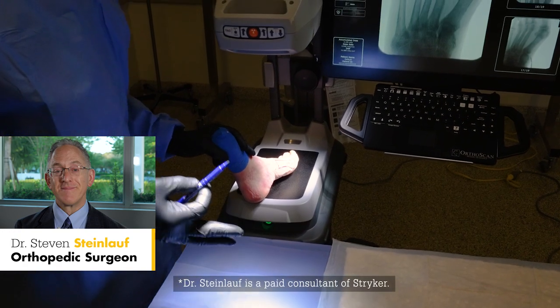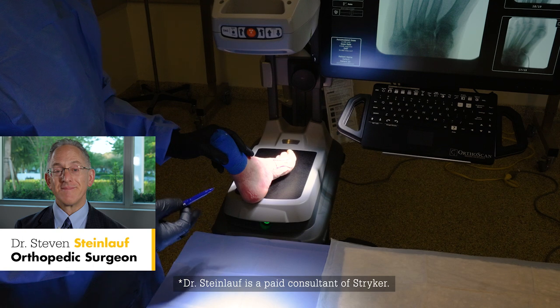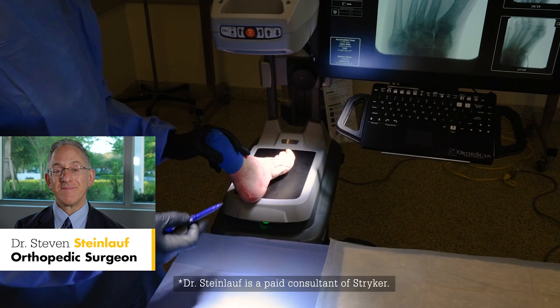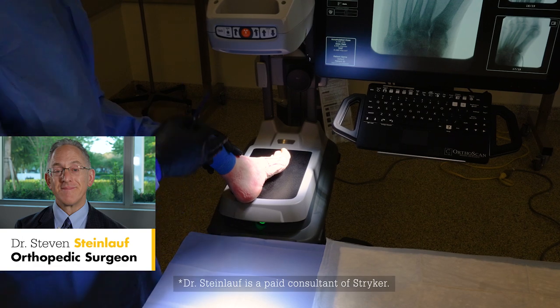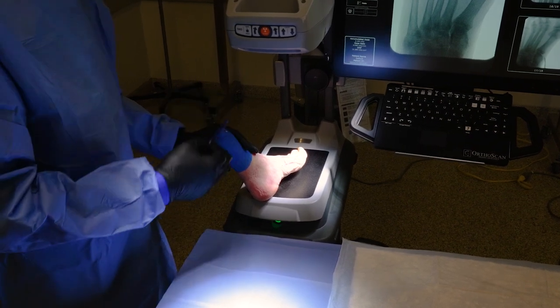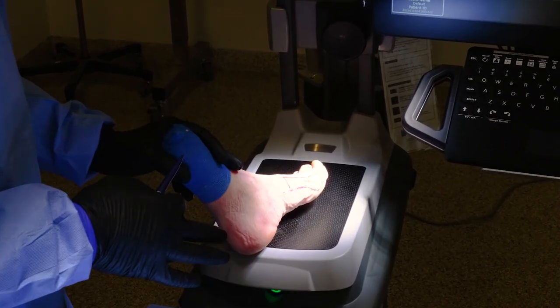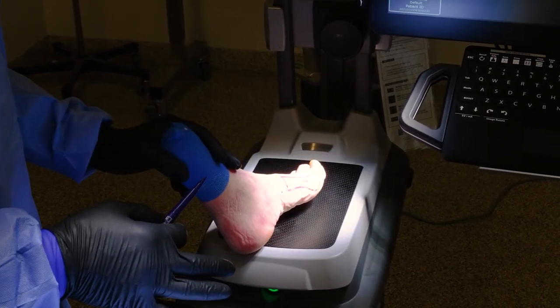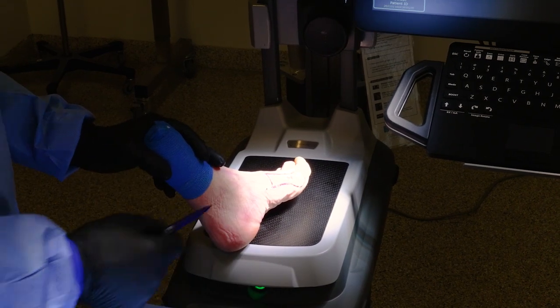We're going to have some fun and the fun part is learning what I do to make this more reproducible. There are better surgeons out there and people who do a lot more of these than I do, but I need this to come out good. I want my results to be as good as anyone else. We're also going to use our Solo Guide for the first time in a video to show how to cut the learning curve way down.